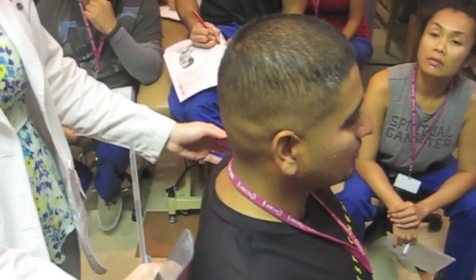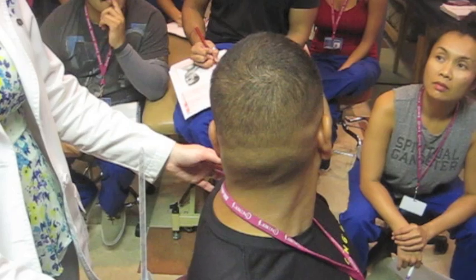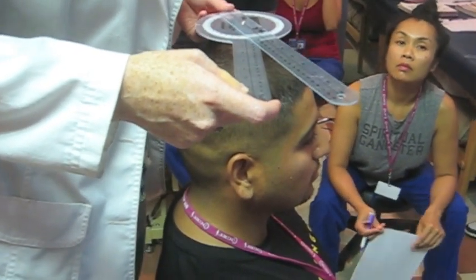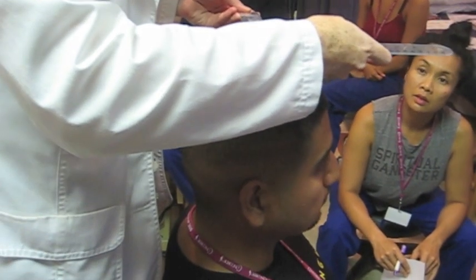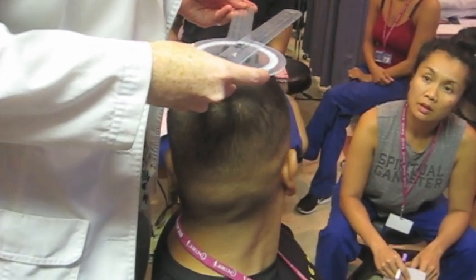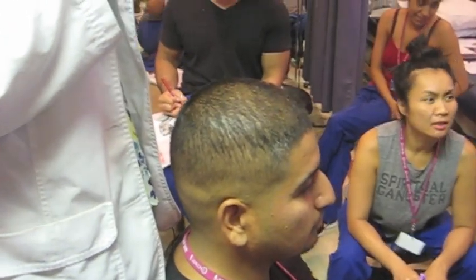Joe, can you rotate your head to the right, please? Very nice. And come back. And to the left. Good. And come back. I'm going to line up my fulcrum, make sure my stationary arm is in place. Go ahead and rotate to your right. And come back. We've got exactly 70. And then I'm going to move my stationary arm over here to make it easier, less confusing on the numbers I'm looking at. Rotate left. And relax. We've got 74.